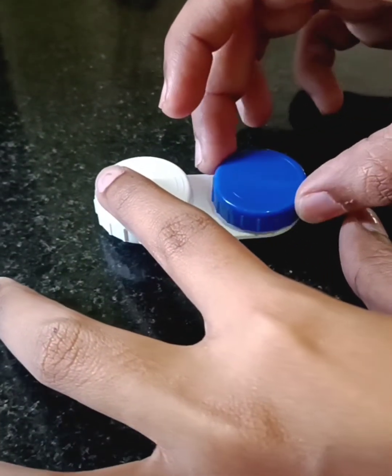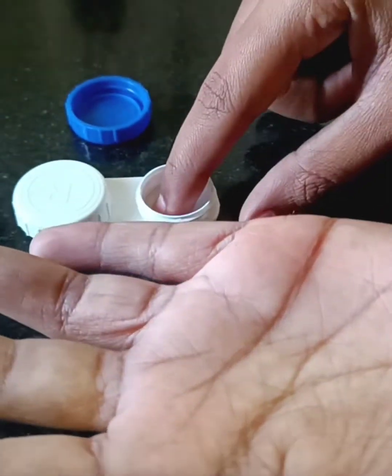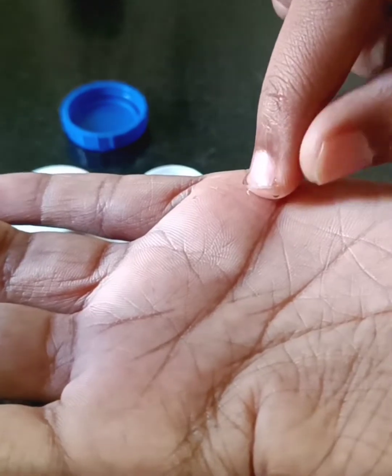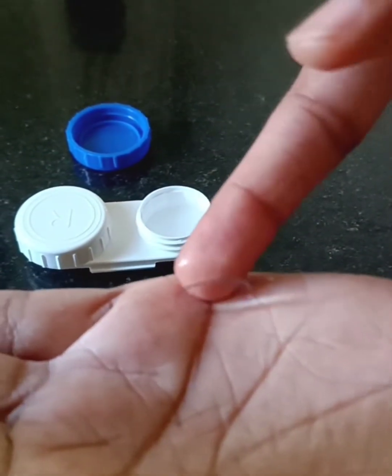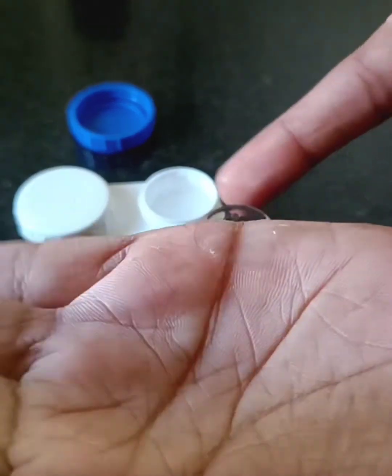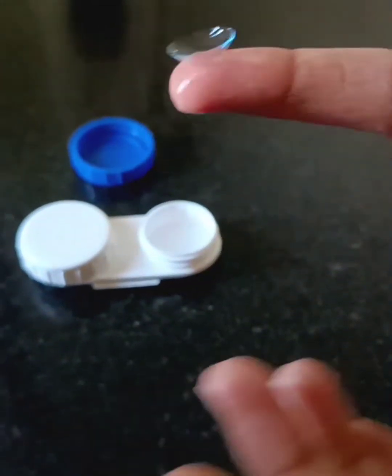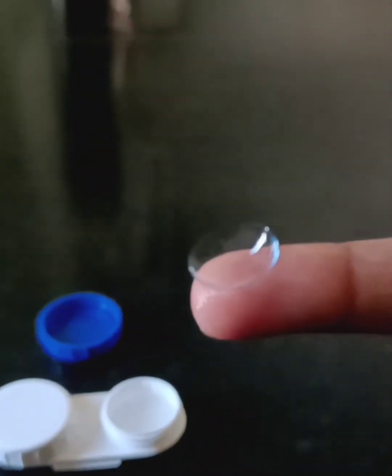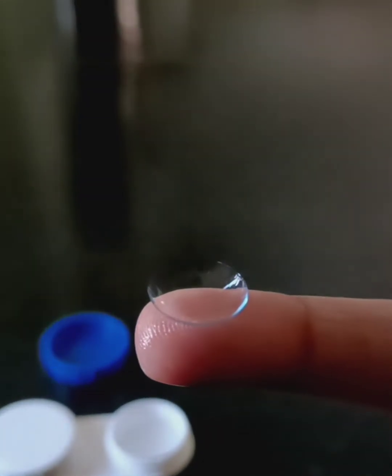Next is the TACO test. It is done to identify the proper orientation of the lens. You have to take the lens and then keep it on the side of your palm. Try to fold your hand — at that time you will see the lens bending. The proper orientation means the edges of the lens should be inward. Here you can see the edges of the lens are inward, so the orientation is correct.